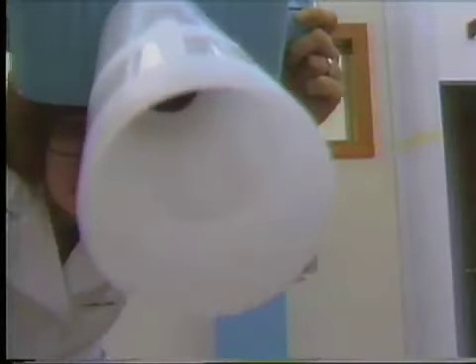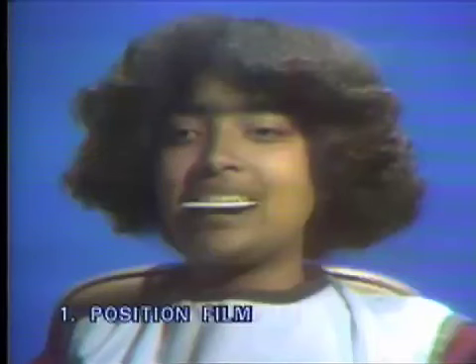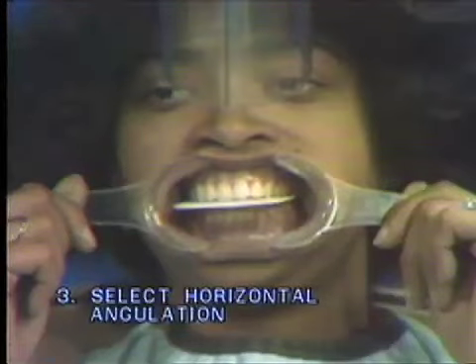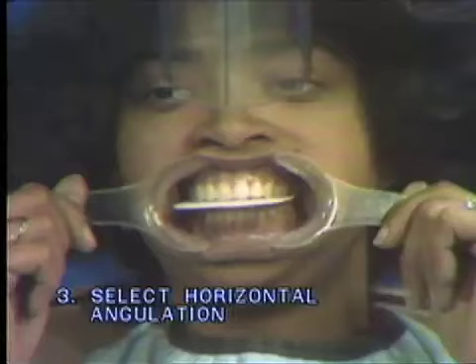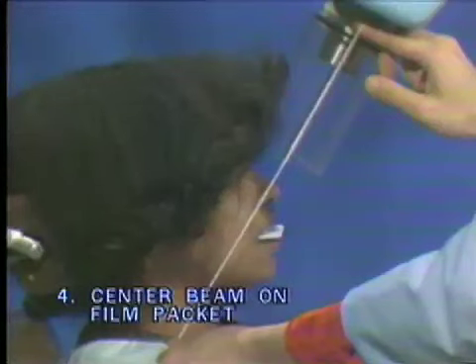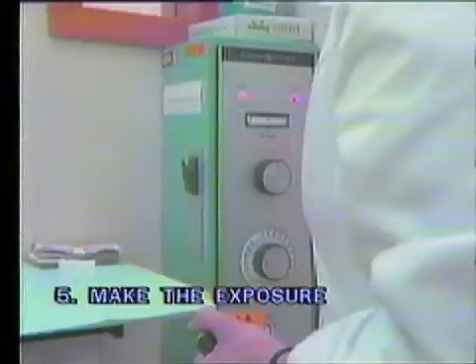While all of the occlusal techniques vary slightly, they all require the same basic steps to produce a radiograph: position the film, select the vertical angulation, select the horizontal angulation, center the beam on the film packet, and make the exposure.